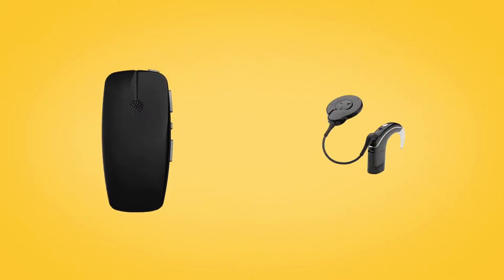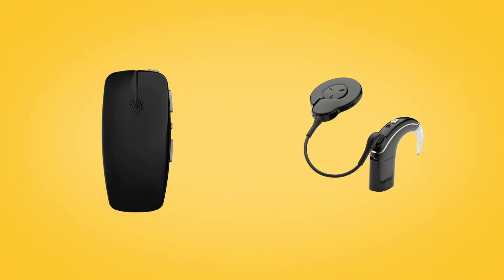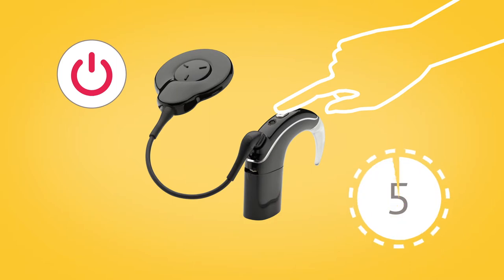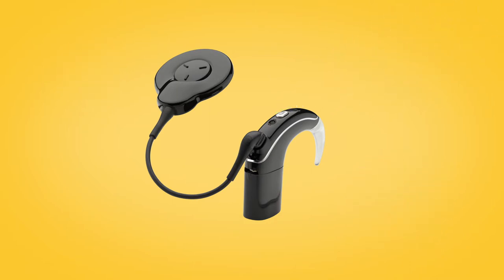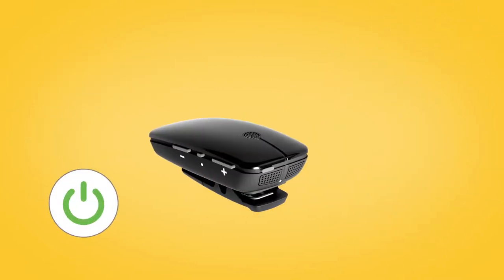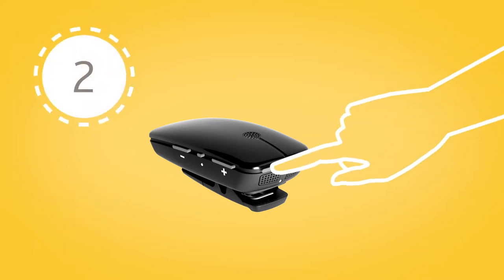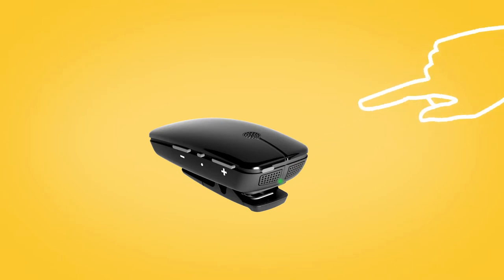To pair your mini microphone with your Nucleus 7 sound processor, remove and turn off your sound processor. Then power on your mini microphone by pressing and holding the on/off button for two seconds until the LED turns green.